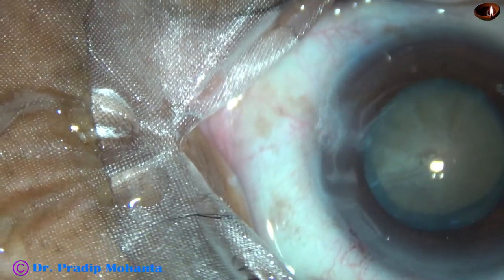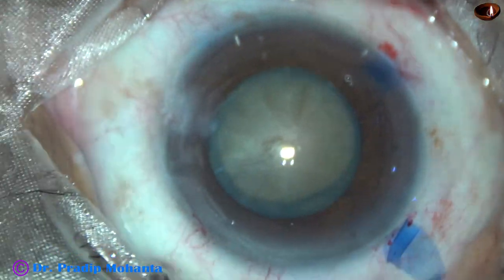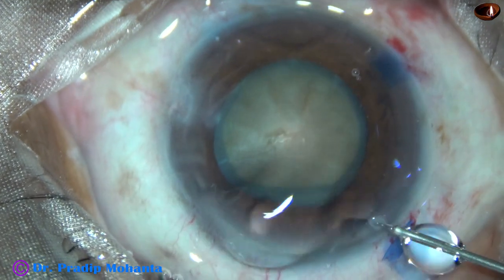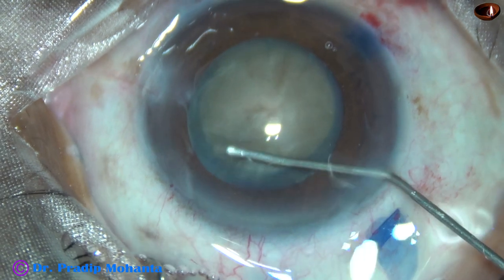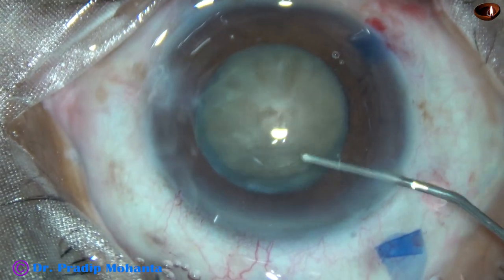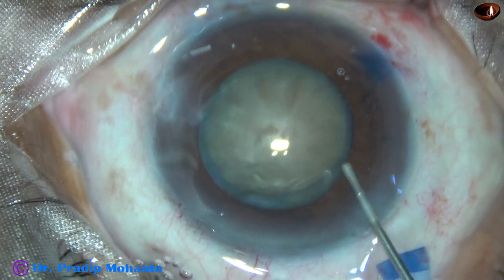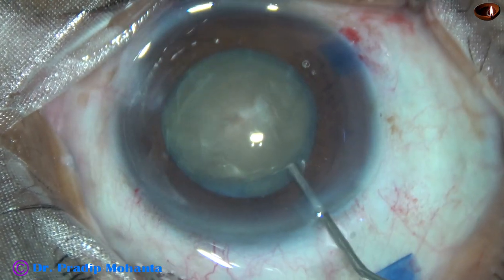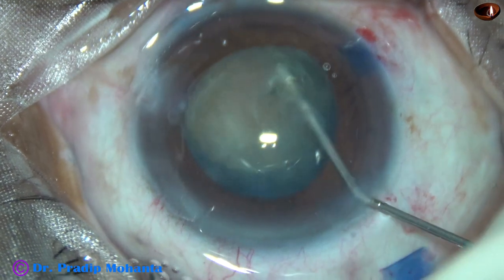And now, hydrodissection. Hydrodissection is done very gently. The nucleus is stabbed and the nucleus is rotated.